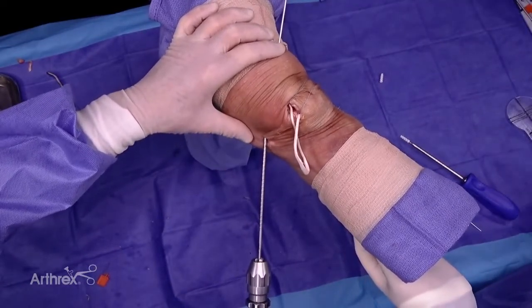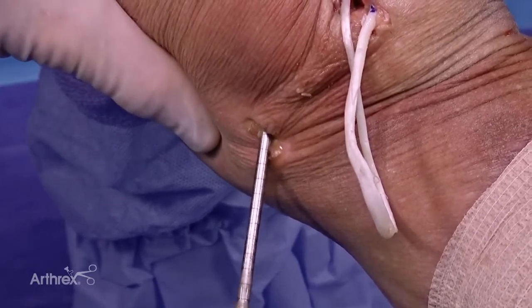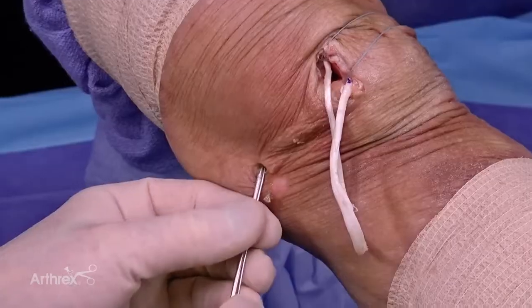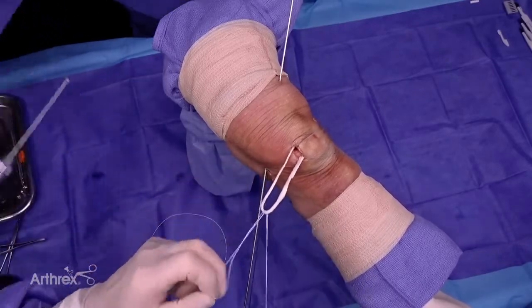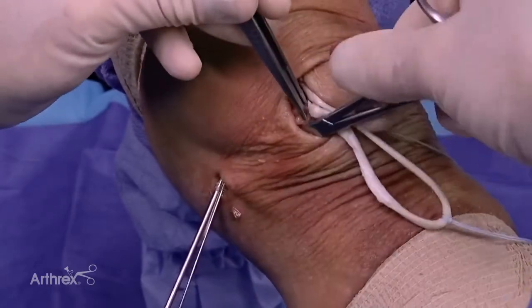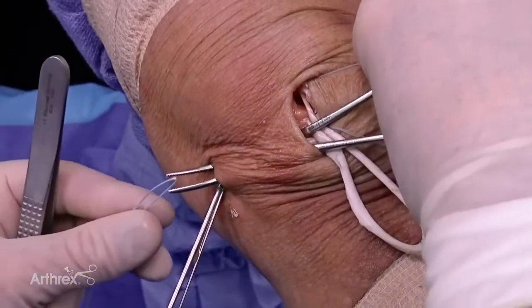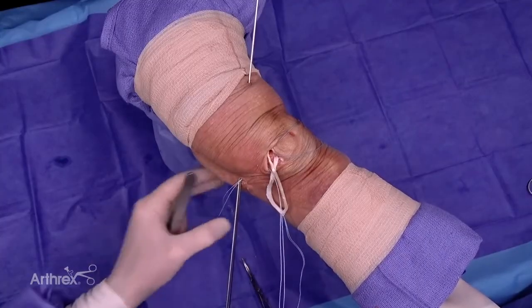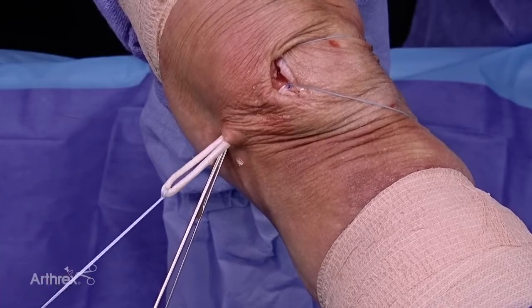Our graft was about 215 millimeters so I give myself enough room for tensioning. The next critical point is to get your nitinol wire and pass it right now so you know your pathway for your screw. At this point I like to place a fiber link in the mid portion of my graft on the tower side to get fixation of the graft right in the middle. I pass my graft extra-capsular — I've got the capsule in my pickups and I just dissect outside the capsule and spread to make graft passage easy. I take a looped fiber wire suture and pull that to the medial incision, then use the fiber link as a shuttle to deliver my graft out the medial incision.